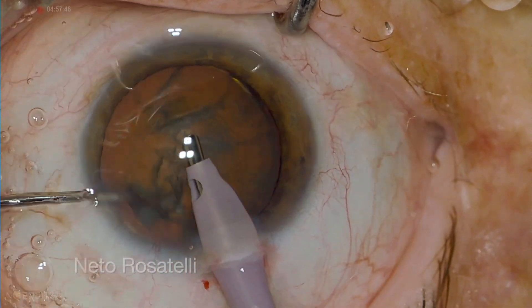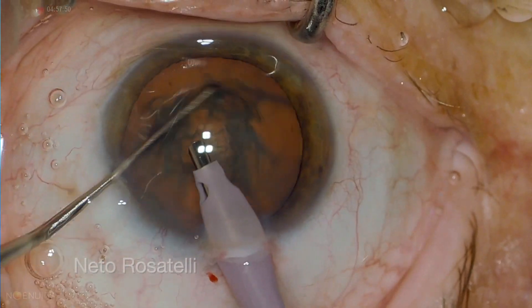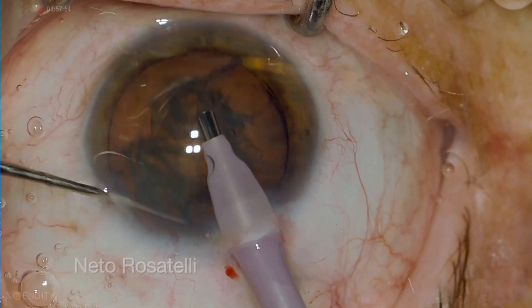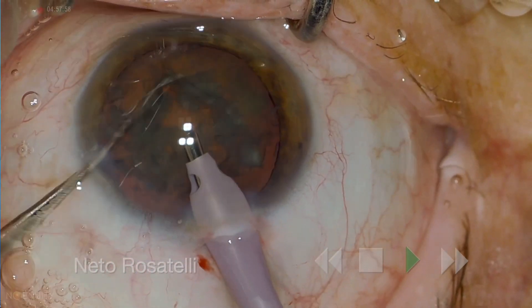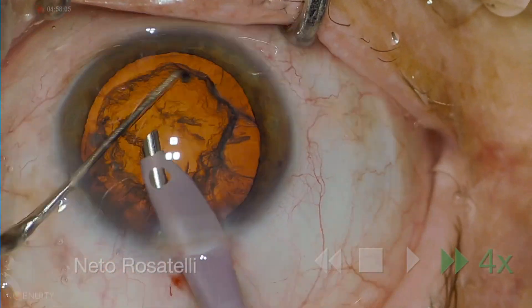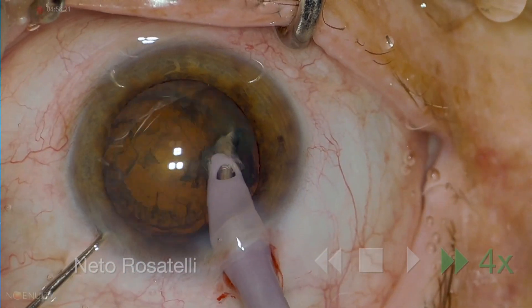Gentle back and forth movements can be employed until the nucleus is free. Then nucleus rotations follow — 10 in each direction in this case. Nucleus management is done with the surgeon's preferred technique, and most of the times, after nucleus management, no cortex is still present.